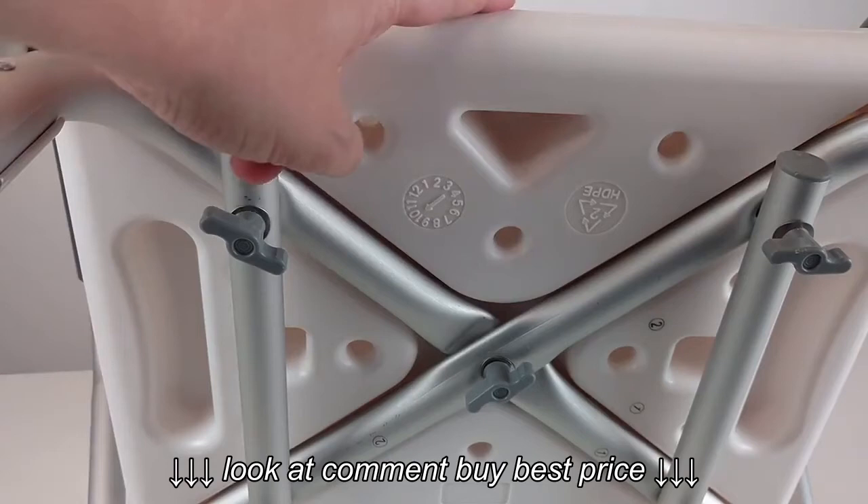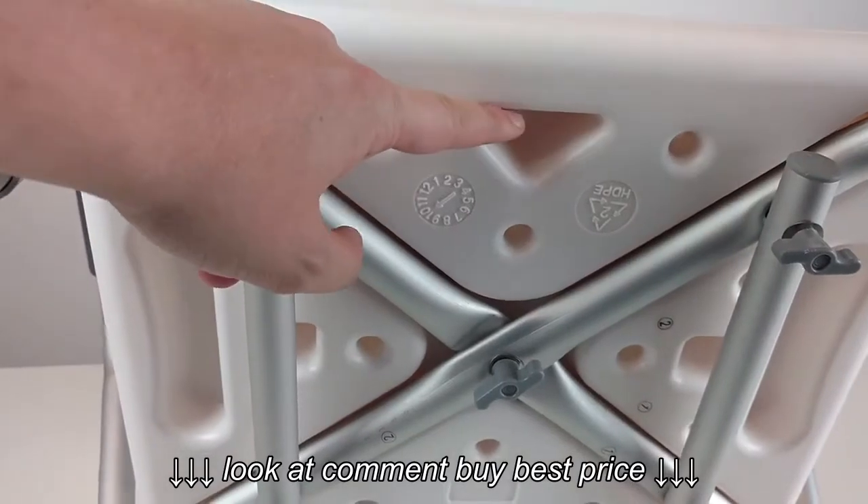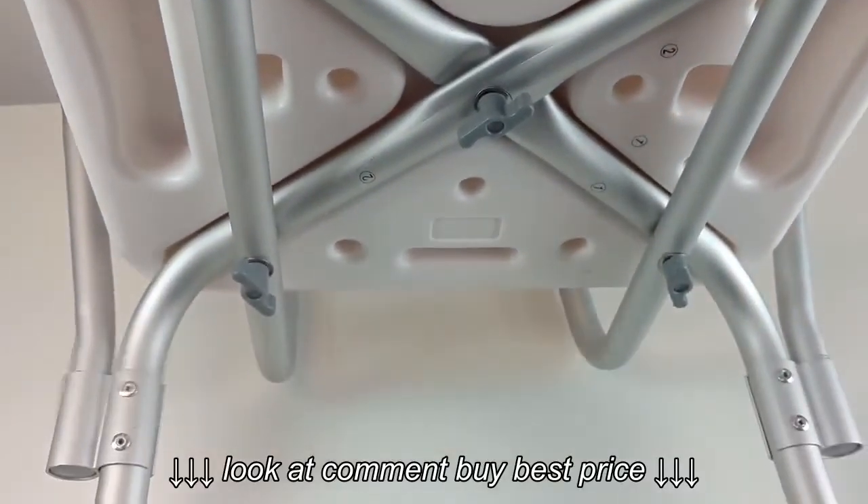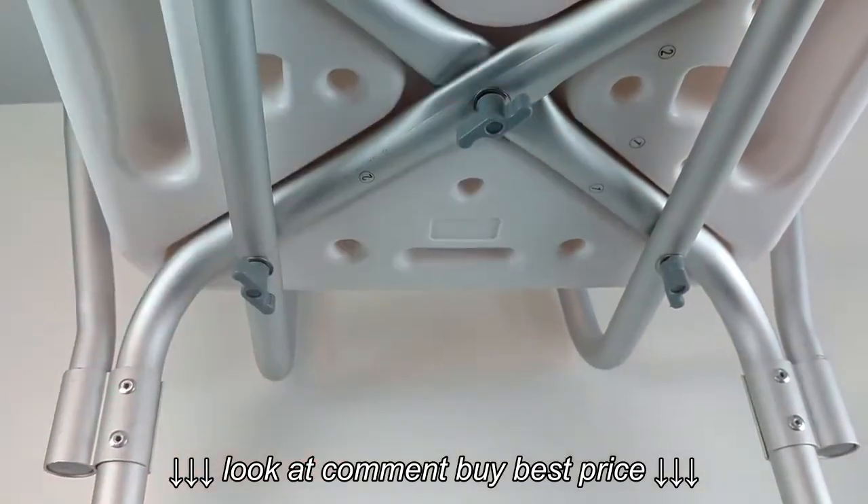This is a troubleshooting video for the Vive shower chair. I've got this one assembled, as you can see. I've got it resting on its back. The triangle part here of the seat is generally the front, and the line down here is the back.